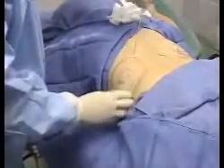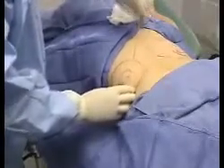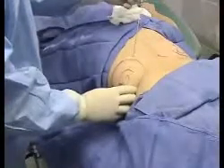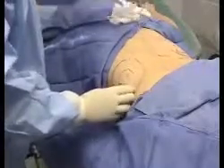So the nurse will call out where we are as far as total joules. We got 25. How many? 25. 25 what? That's from 100. Okay.